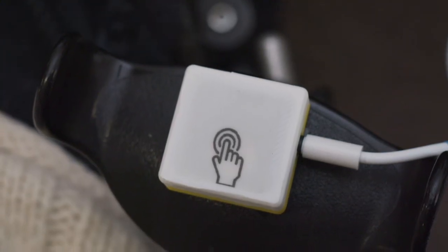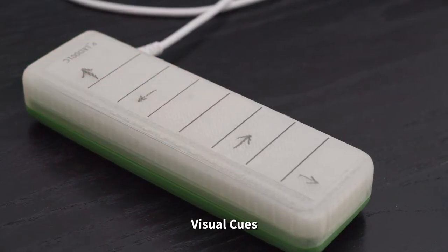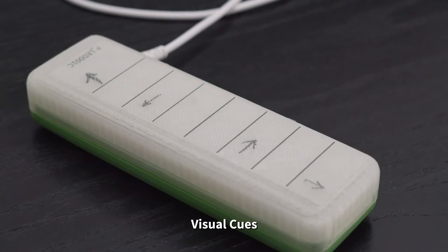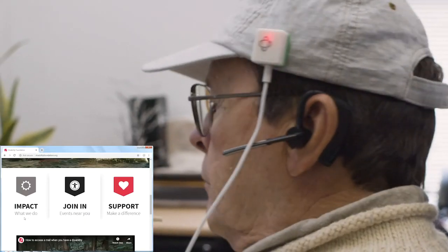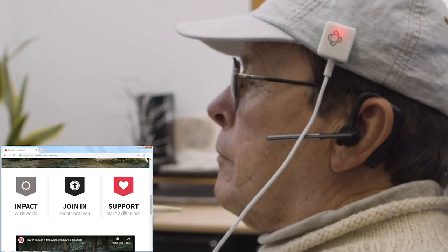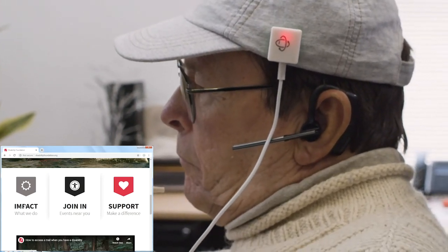With the touch sensor, a light box can be added to indicate the mode that the peripheral is functioning in. The light indicates which mode has been selected. With the gyro, the rate at which you need to turn your head to control the cursor or activate a mouse click can be customized for each user's comfort.